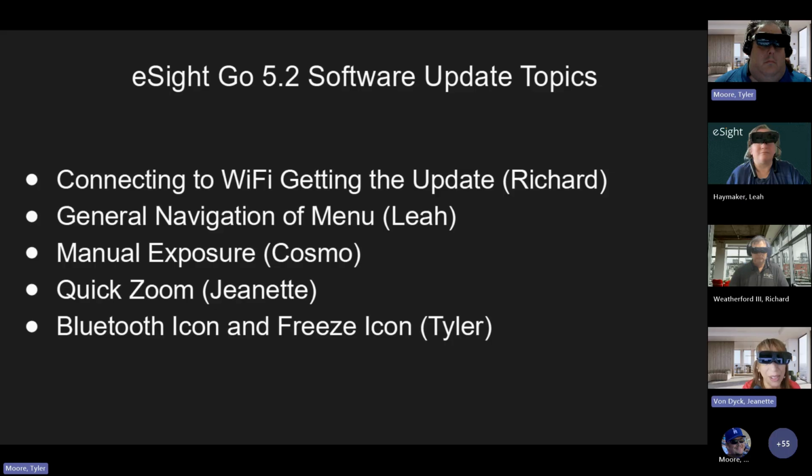You need that level of zoom, however, you want to quickly zoom out and have an overall perspective of the picture. So if you press and hold that upper left button on your remote while you're zoomed up on, say, 10 times zoom, it's going to immediately zoom you back out to 1 time. So it's going to zoom you back to the default of 1 time before any zoom has been added.